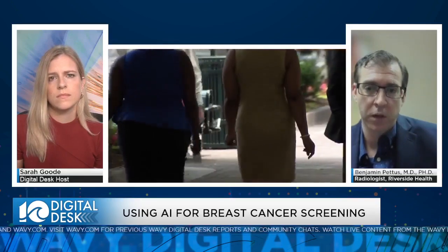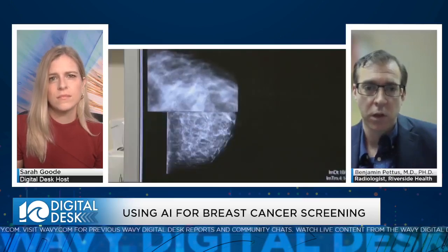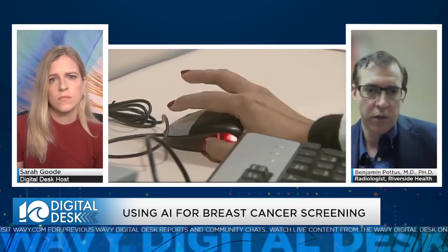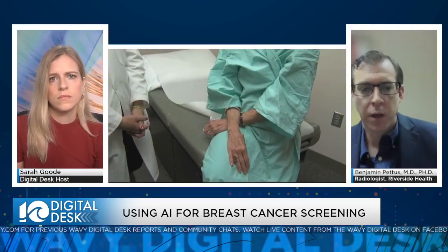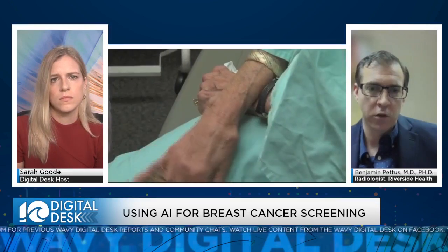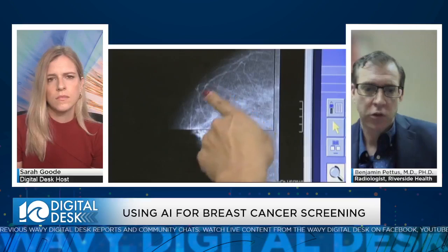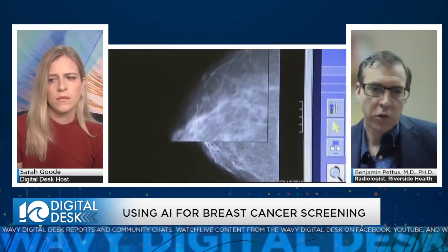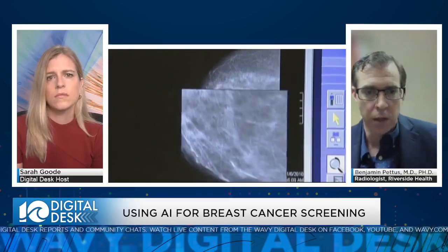But it does add a lot of work to the radiologist, because a mammogram screening has gone from 4 images to really thousands of images, and they're stacked kind of the way a CT scan is, where you can sort of scroll through that tissue. But having the AI is a good safety check for the patient because, with that extra number of images, there's always a risk for human error and fatigue, which we want to eliminate.